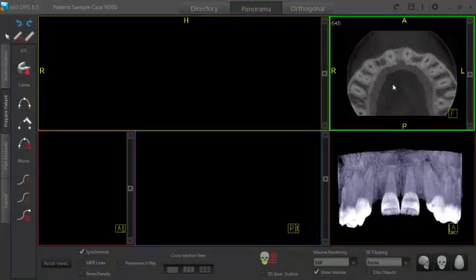Good afternoon, my name is Matthew Howell. I am the Sales Director here at 360 Imaging. Today I will be demonstrating how easy it is to plan an implant case and order a surgical guide using our 360 DPS software with a CareStream 9000 scan and Tomin implants for this presentation.